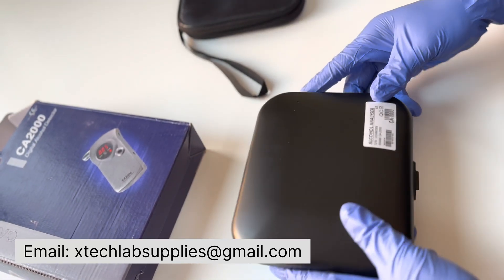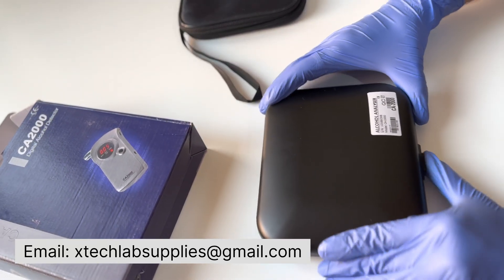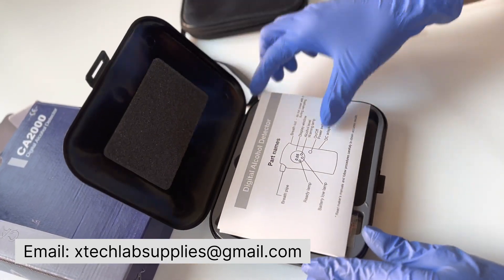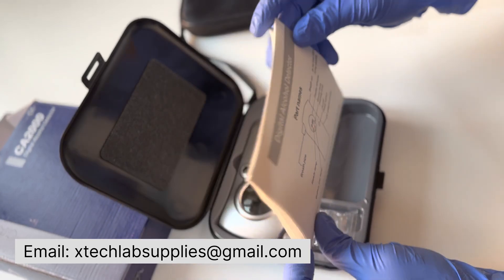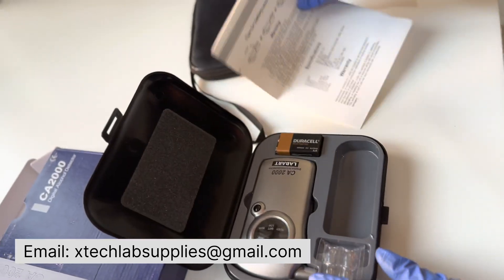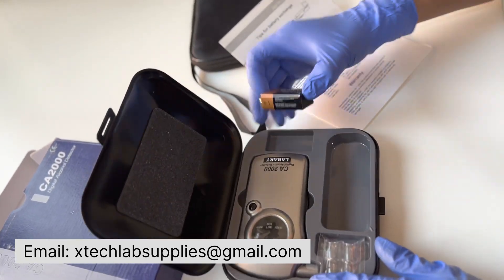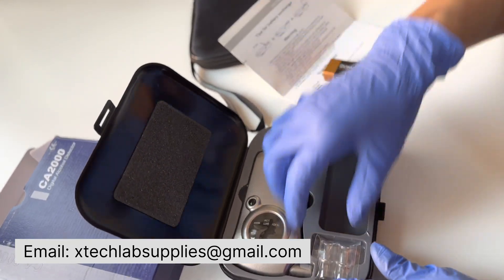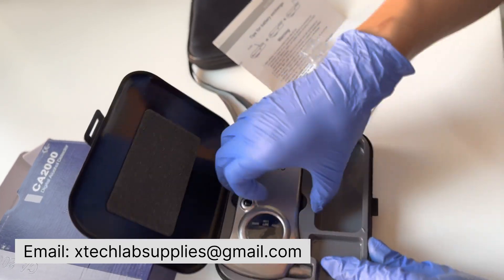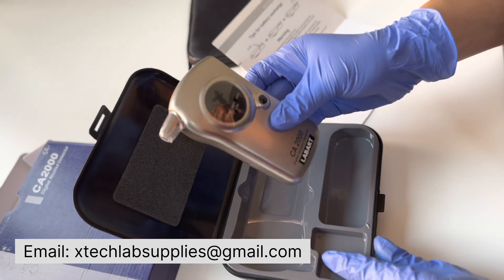It is a very handy and portable kind of instrument. Inside the case, you will find a manual. Always refer to the user manual before you start using the instrument. You will also find one 9V battery, a few mouthpieces, and the main instrument.